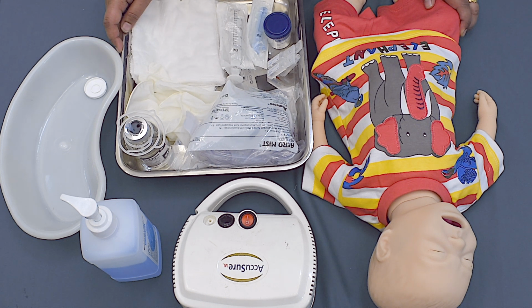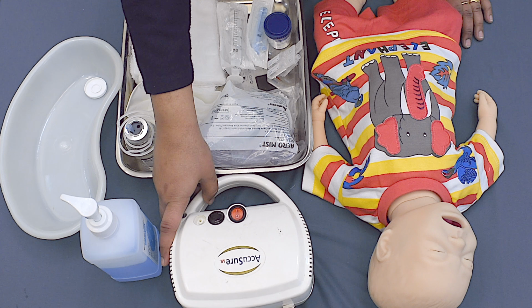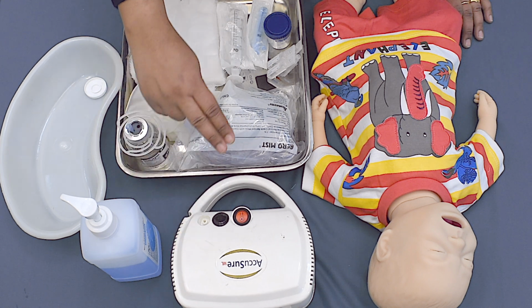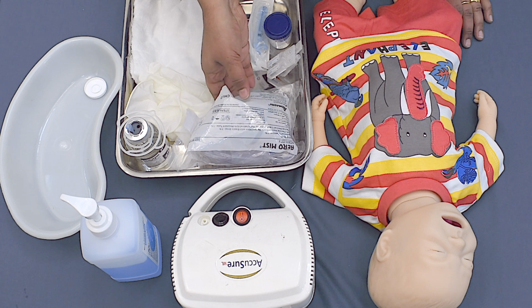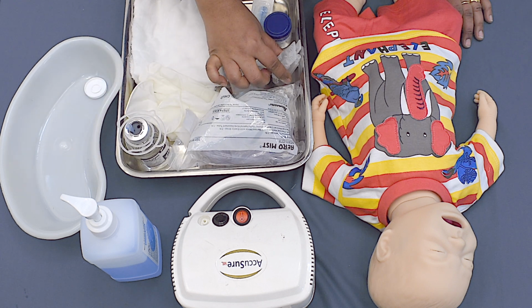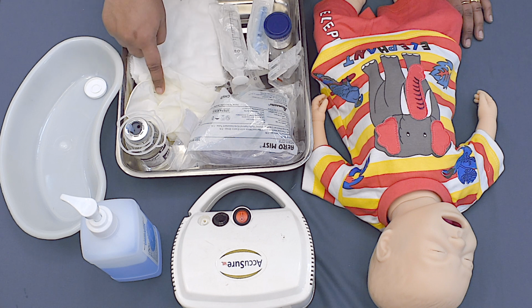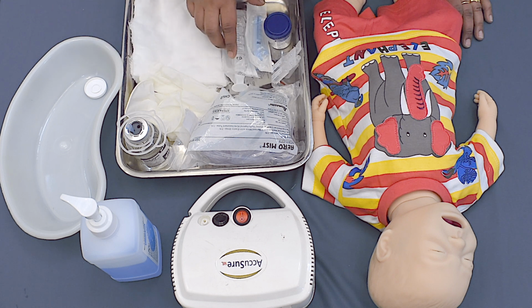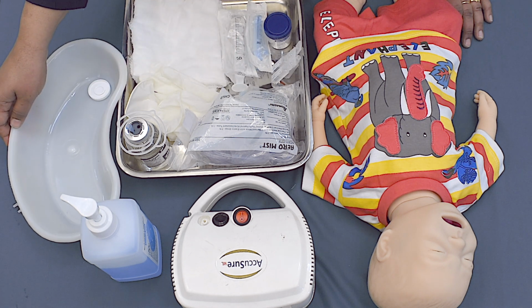So, for this procedure we need a compressed gas source or a nebulization machine, a nebulization kit, normal saline, prescribed medications, a pair of clean gloves, some dressing pads or a face towel, syringes of appropriate sizes and a kidney tray.